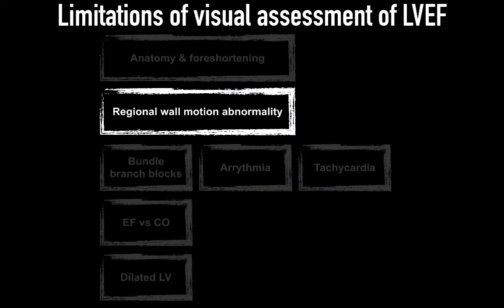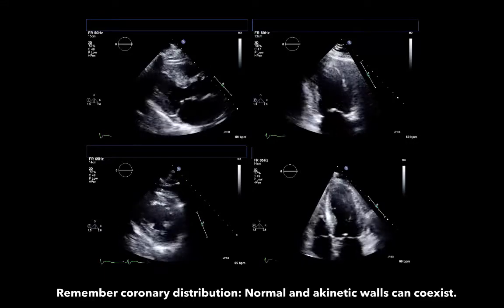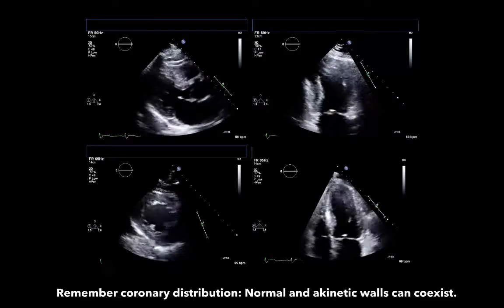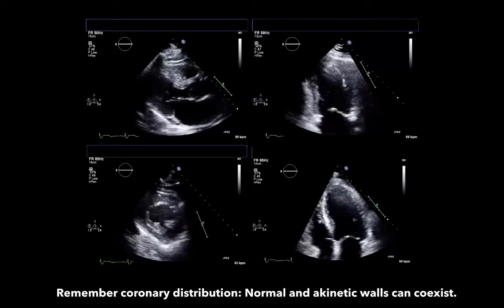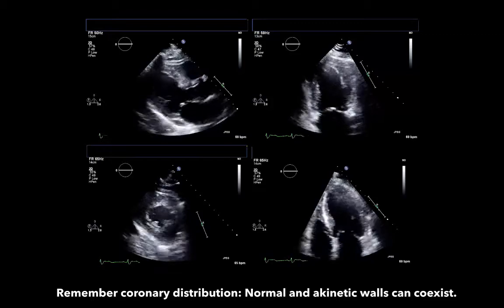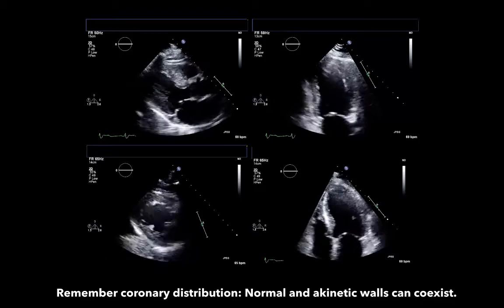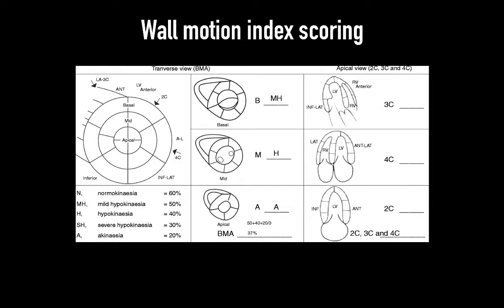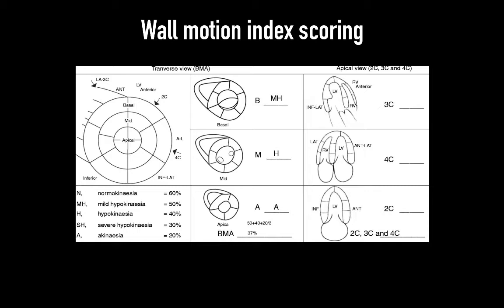Regional motion abnormalities present another pitfall. In this set of clips — all from the same echo — there is significant hypokinesis in the anterolateral and infralateral/septal walls. Comparing the views, the parasternal long axis view on top left has markedly lower LVEF compared to the rest. Because of coronary distribution, normal and akinetic walls can coexist, causing apparent variation in ejection fraction. This illustrates the challenge of using 2D planes to evaluate a 3D structure — multiple views must be used. A wall motion index scoring system has been developed to quantify LV function across every wall segment and average them, though in real life, intact walls can overcompensate for dysfunctional segments.